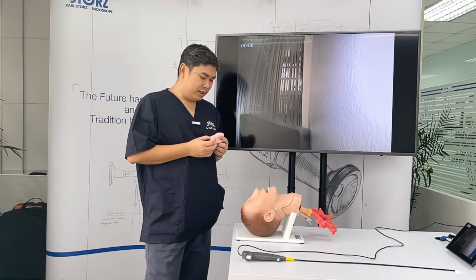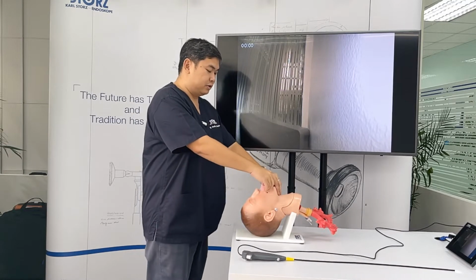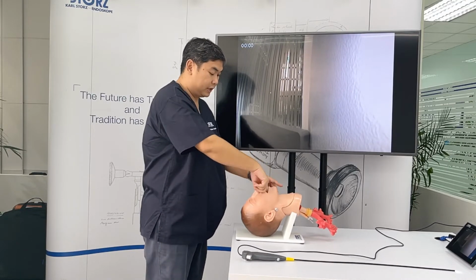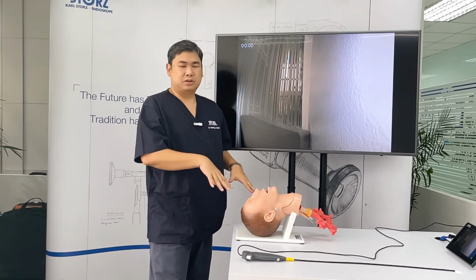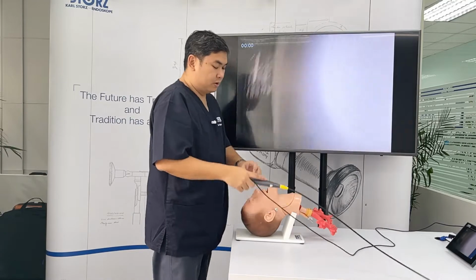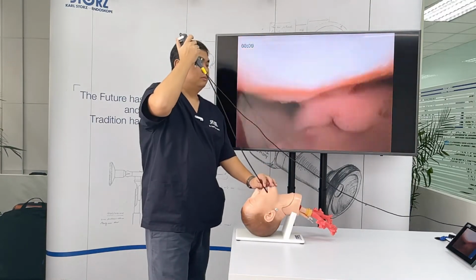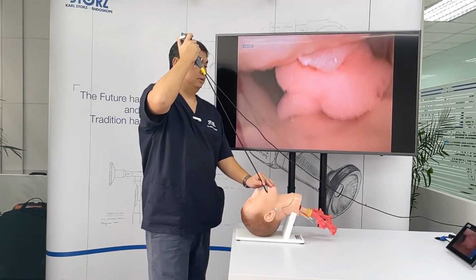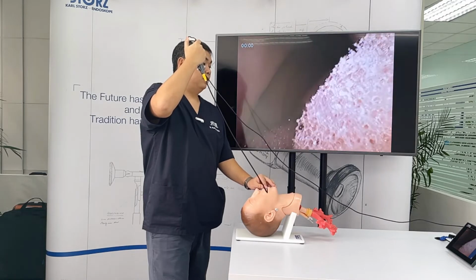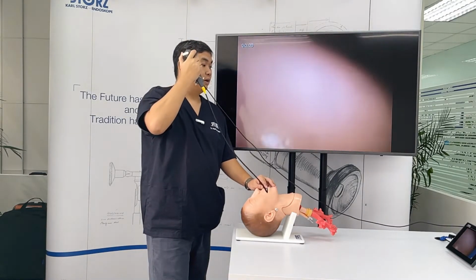Also, what I do is I get a sponge, insert it on the mannequin's airway, then it will serve like a tumor. So every time I place it, it's in a different place. So for example, for this one, the airway is here. I will go here.